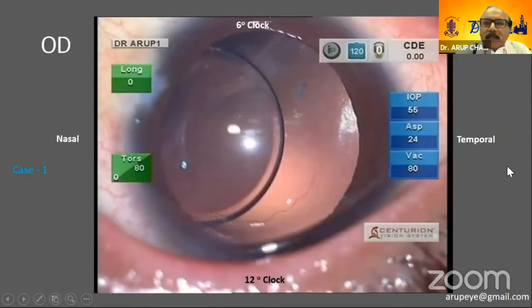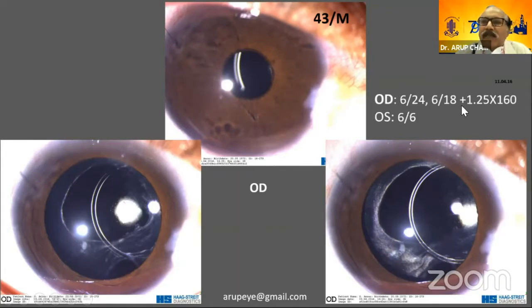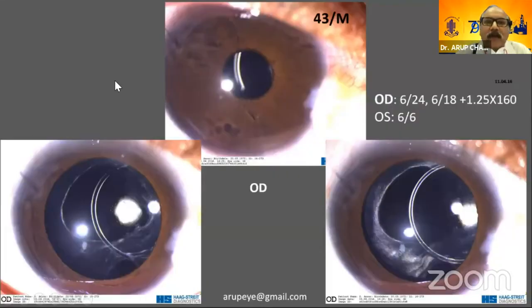So this was a patient that came to me, east-west decentration, and preoperatively, if you see carefully, the lens margin bisects the pupillary area. On dilatation, this is seen to be very, very significant. As expected, the quantity of vision is not satisfactory. It is only 6/18 with best correction. And we also expect the quality to be affected because of the age and the dislocated intraocular lens.